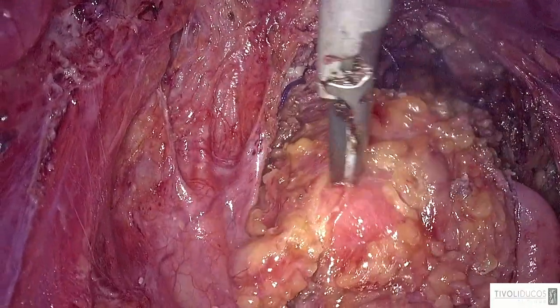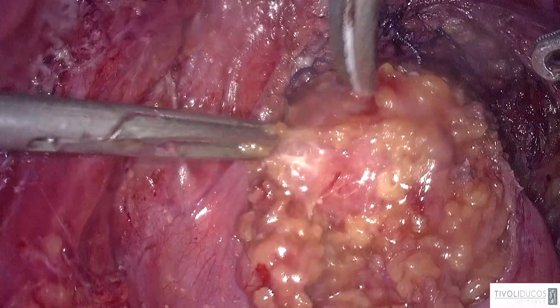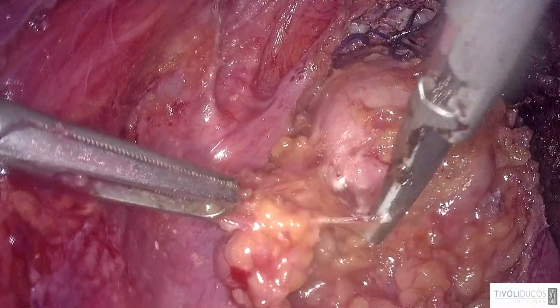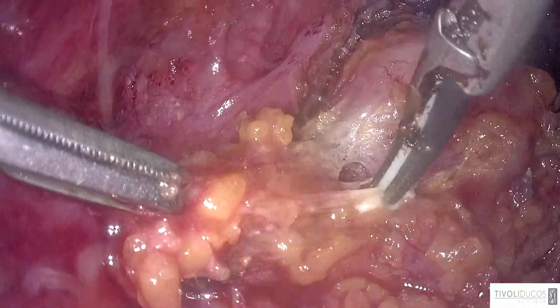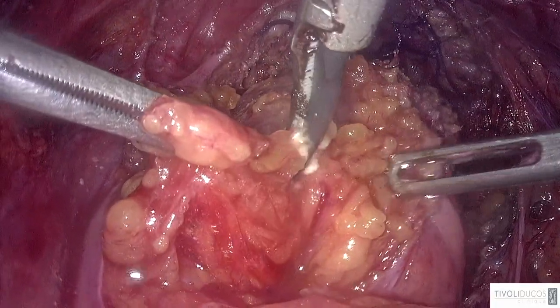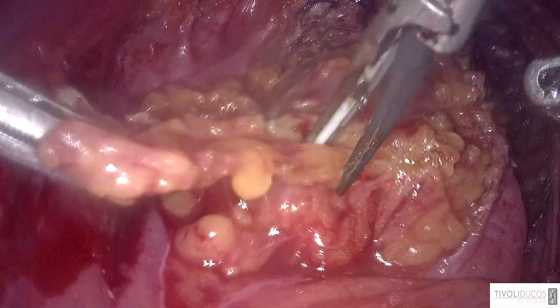Okay. Here I have to go a bit farther. So we have to remove all these vessels. If I leave them behind, they can be responsible for rectorrhagia because they can be closed in between two staples and they can bleed. So we may have postoperative rectorrhagia, which is very difficult to manage and renders the patients and the team very anxious. And second, it seems that the fat tissue is more likely to have a necrosis and you may have a fistula. So to reduce the fistula and the rectorrhagia, we prefer to remove all this fat tissue before closing the stapler.